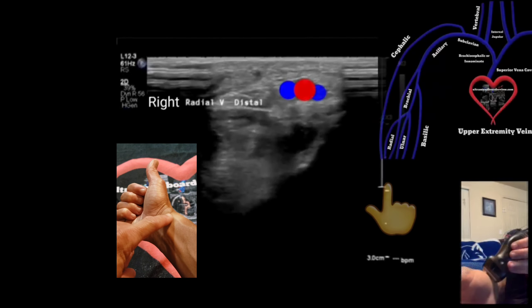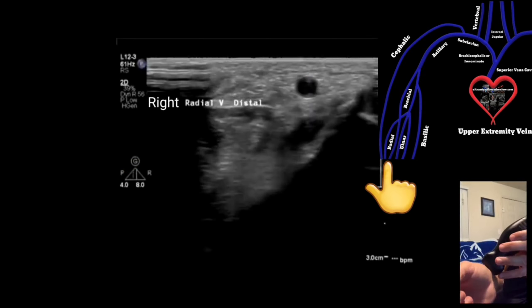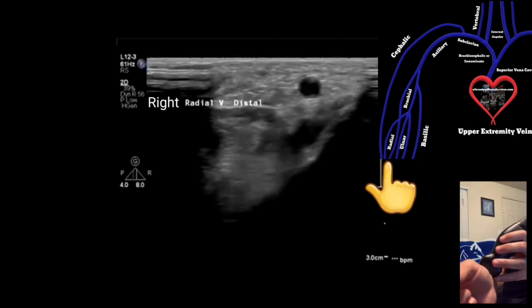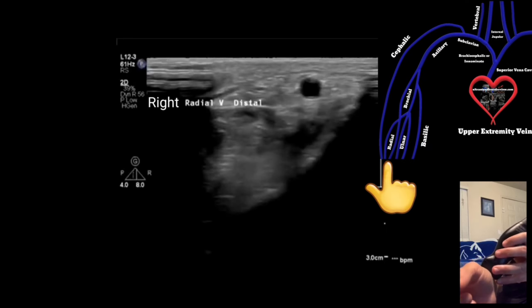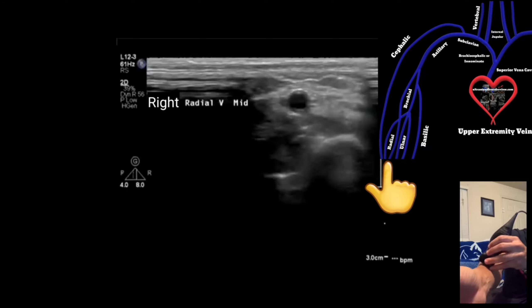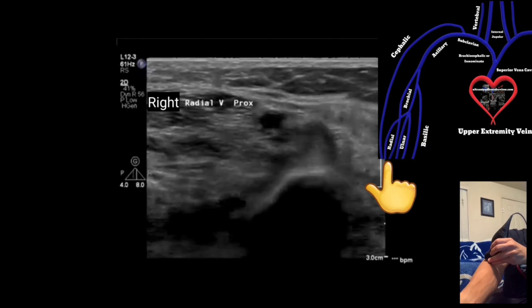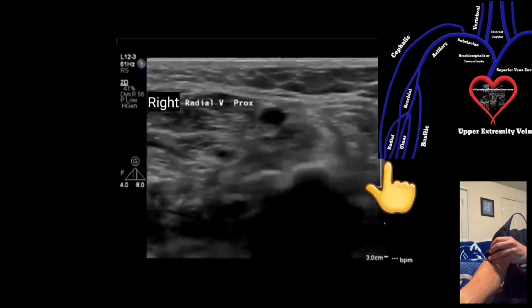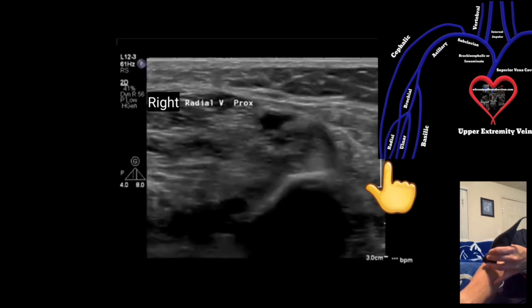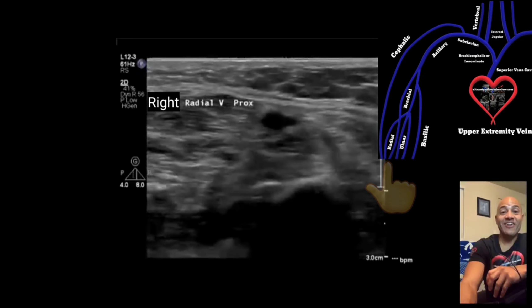Next you're going to go to the radial veins, which are on the lateral side of the patient's wrist. Stay in the transverse view and acquire images of you compressing the radial veins. Then move to the mid area and compress the radial veins, then move proximally and compress there as well. You don't need to go to your sagittal view for any of these veins if you don't want to — it's perfectly fine to stay in the transverse view.